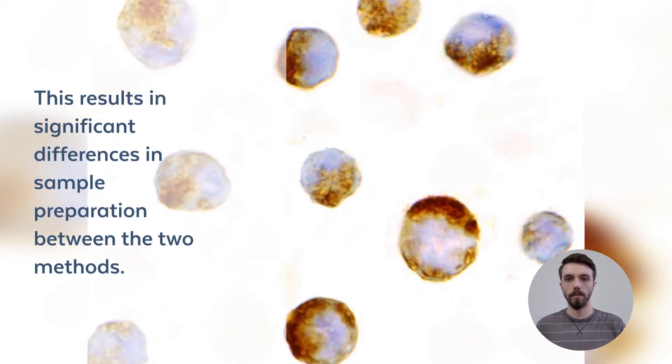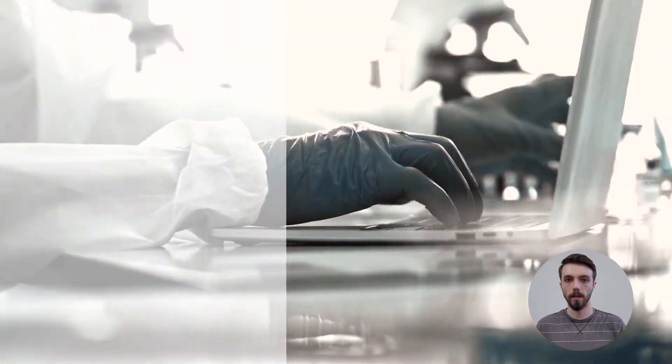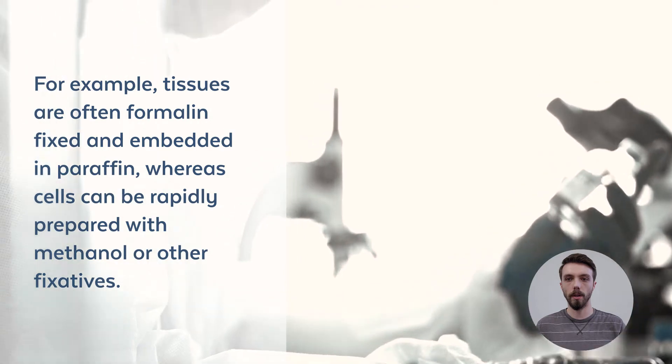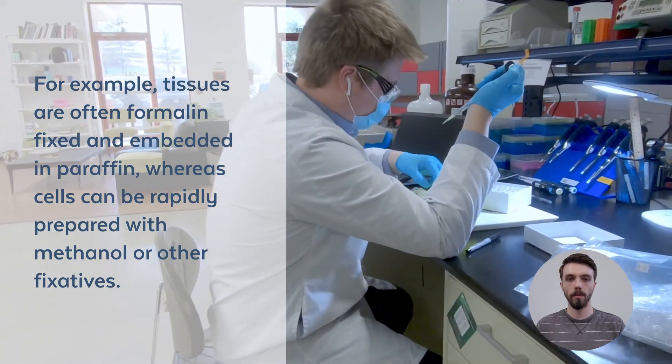This results in significant differences in sample preparation between the two methods. For example, tissues are often formalin-fixed and embedded in paraffin, whereas cells can be rapidly prepared with methanol or other fixatives.